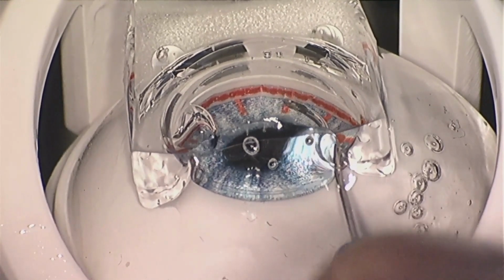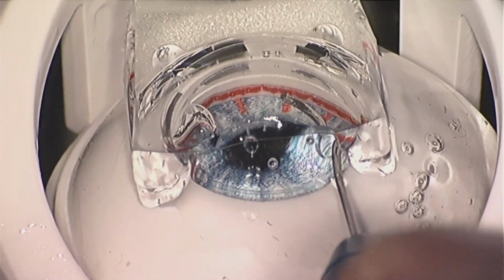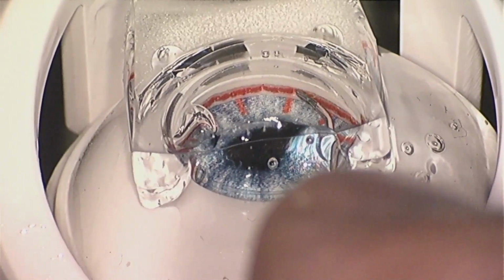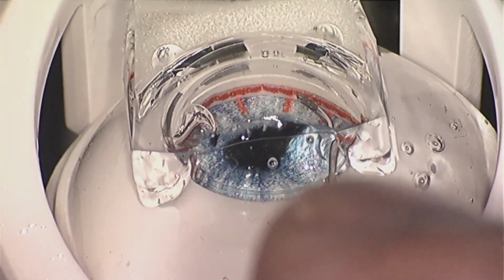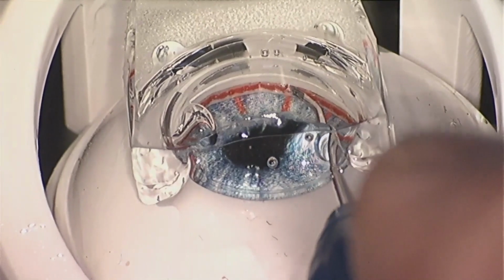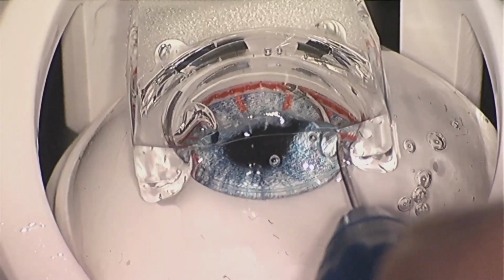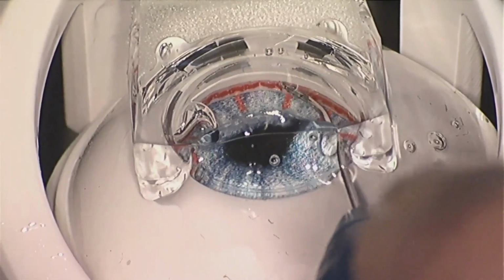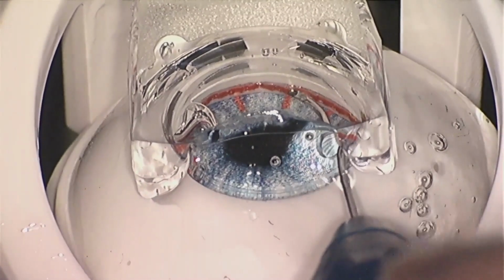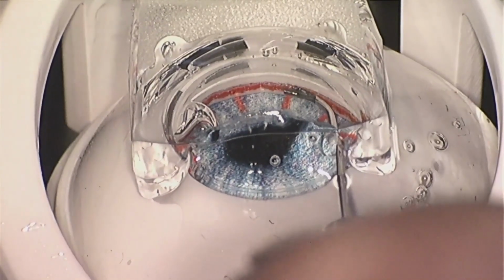So again, we're back in the wet lab, this time with the Hydrus stent, and what I'm showing here is just how the proper angle is what you need. So you want it angled towards the cornea about 15 degrees, and then this tip of the injector system is kind of like a needle, and so you want to just bury that bevel just a little bit, and that allows the stent to get deployed into the canal. It's deployed on a wheel mechanism, so you're just gently rolling your finger down the wheel, and it's intuitive because you're wheeling it away from you, which deploys the stent. And here you can see the stent getting deployed into the canal behind the trabecular meshwork.